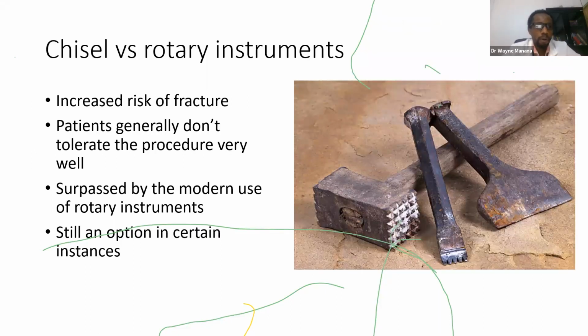I will not talk so much about chisel and hammer. I know those of us who are working in remote areas in the districts sometimes don't have the rotary instruments. Sometimes we don't have the piezoelectric machines. So we might be forced to use our chisel and hammer, but please bear in mind that there is always an increased risk of fractures, and most patients don't like chisel and hammer because of the noise. So it has been surpassed by rotary instruments, but it's still an option.